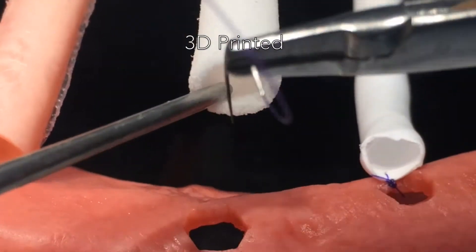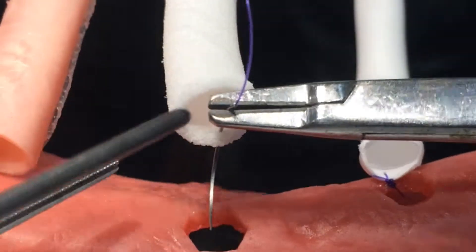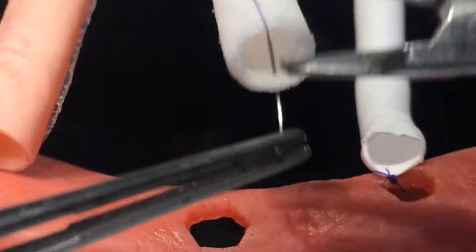First, for the TPU 3D printed material — you can see it's really stiff. When you grab it, it doesn't give in that much. It's almost too rigid to pass the needle.